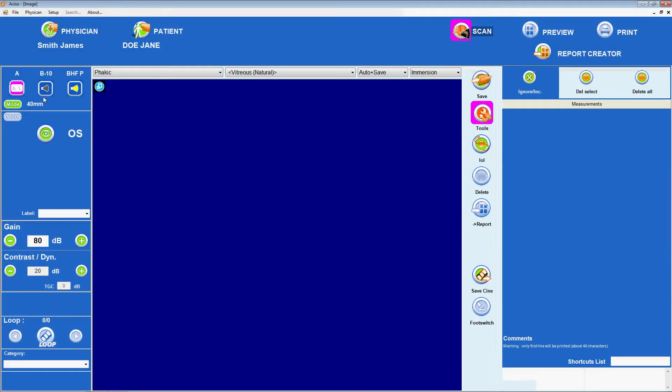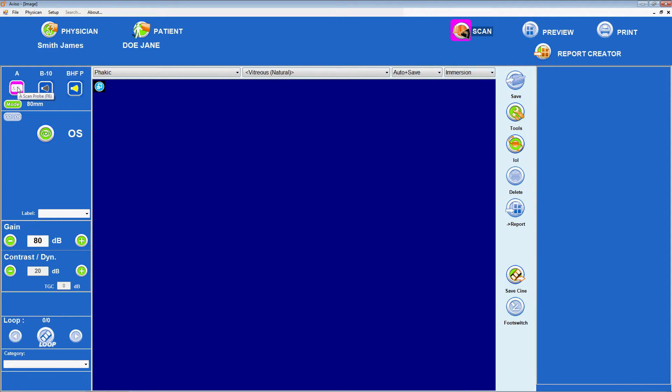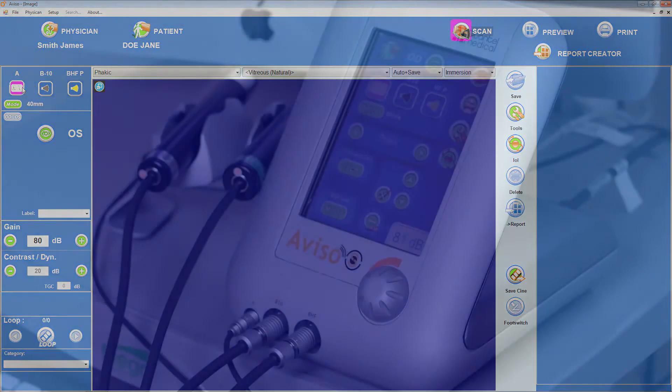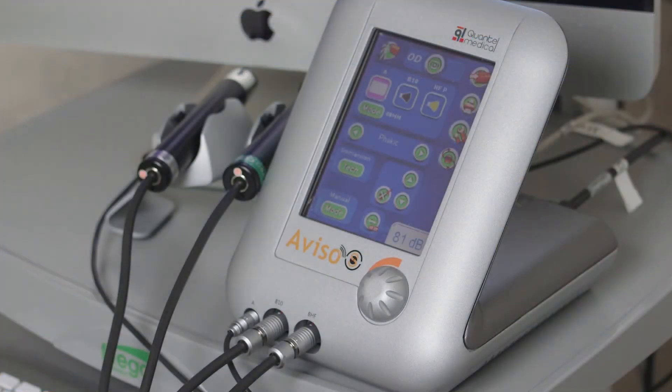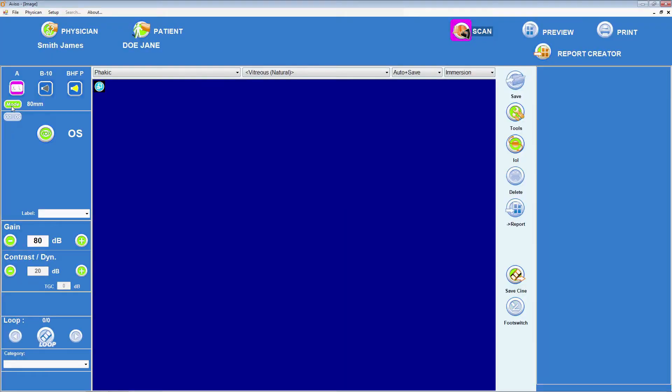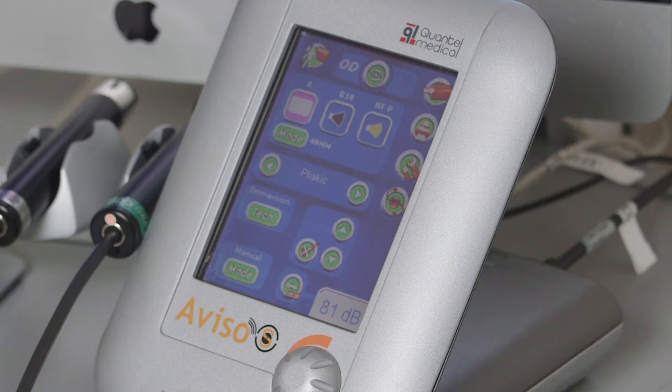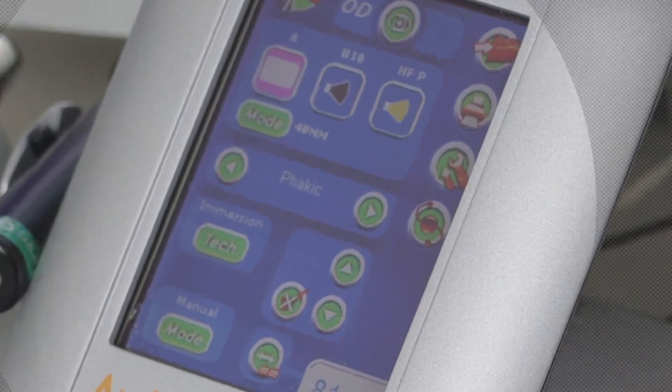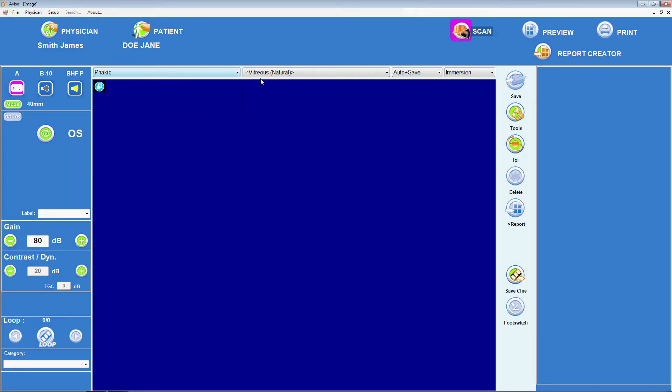Access biometry mode via the biometry A icon. Once selected, we can set other parameters for the scan either through the touch screen interface or via the computer screen and mouse. On the touch screen, we can toggle the green mode button just beneath the probe menu to choose the depth displayed, 40mm or 80mm. The mode button is found on the left-hand side of the computer screen view. The lens status, Phakic, Aphakic or Pseudophakic, can be selected by touching the green arrows surrounding the default, Phakic in the middle of the touch screen. Just below that, the technique, Immersion or Contact can be selected. Finally, in the bottom left-hand corner of the screen, the acquisition mode, Manual Auto or Auto Plus Save can be set. Alternatively, these options can be customized via the drop-down menus at the top of the acquisition screen on the computer.